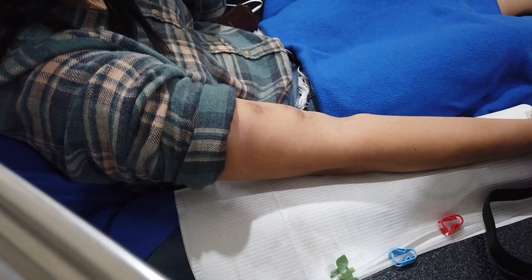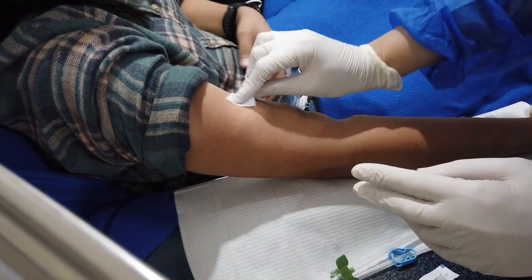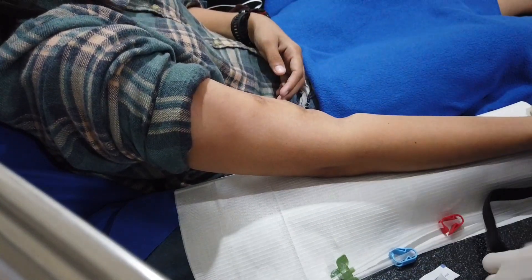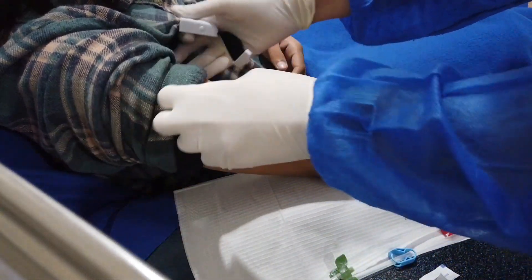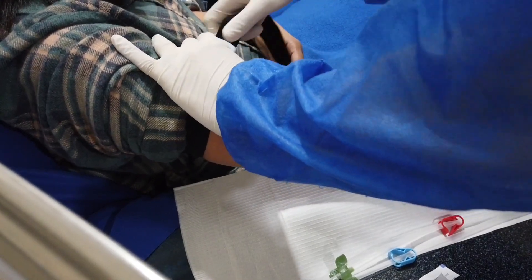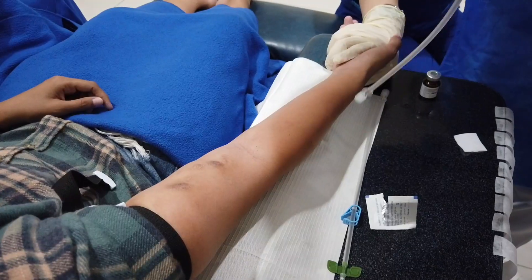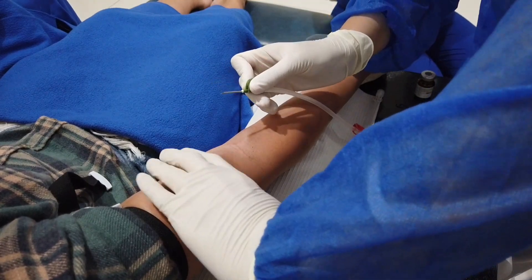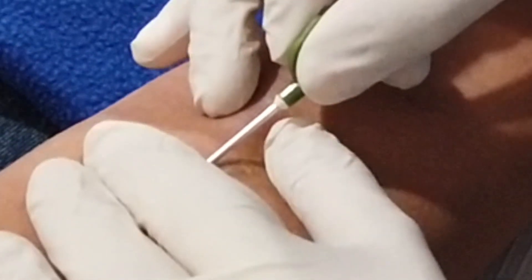I'm preparing the heparin here for the whole treatment and not for cannulation. Don gloves. Alcoholize. There are patients who are allergic to betadine, so always assess first. Apply tourniquet. Assess and touch the skin — doing so can help glide the needle easily and at the same time lessen the pain.